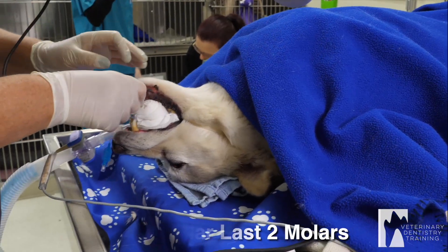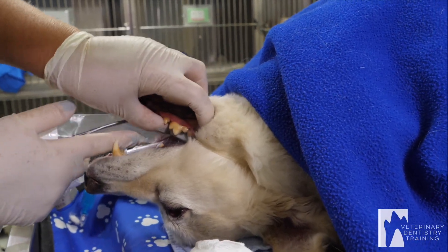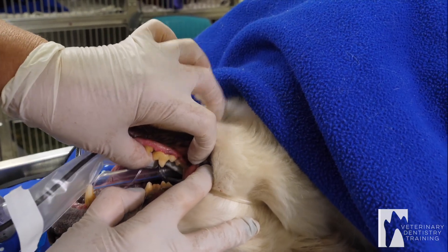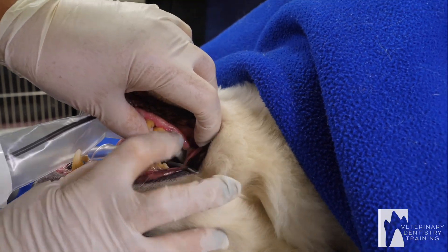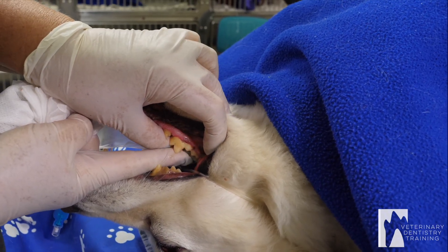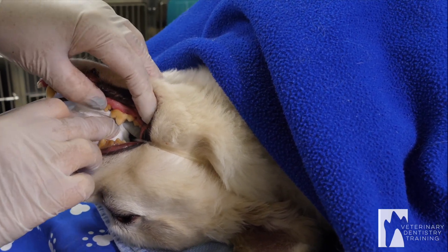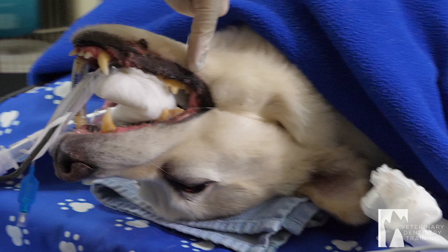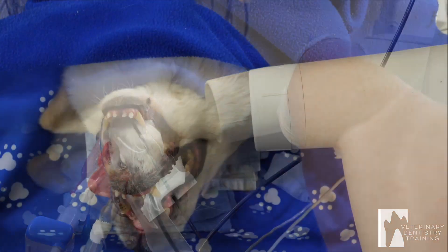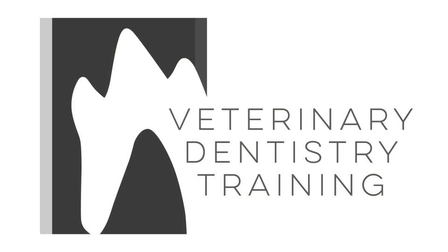Now I'm going to do the back teeth. Make sure your mouth gag is in for this, because if they get light and bite down your fingers are going to get hurt — not to mention the sensor is $8,000. Bring it back as far as you can go, and then from the outside I push down so that sensor is sticking up past that last molar. I put pressure on the front corner so the sensor is sticking out, then take my gauze and put it in the front corner. I center on the last molar parallel, but then come back and tilt forward still centering on that last molar — it's actually a peace sign from above. X-ray.